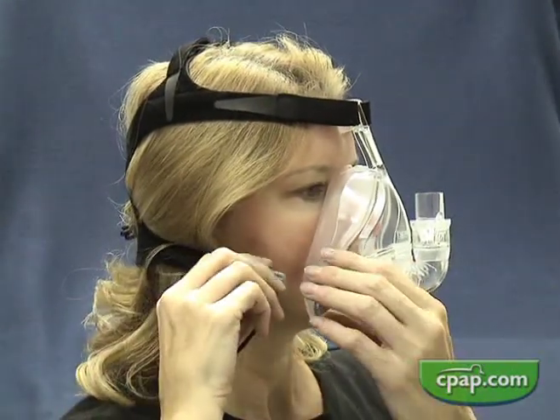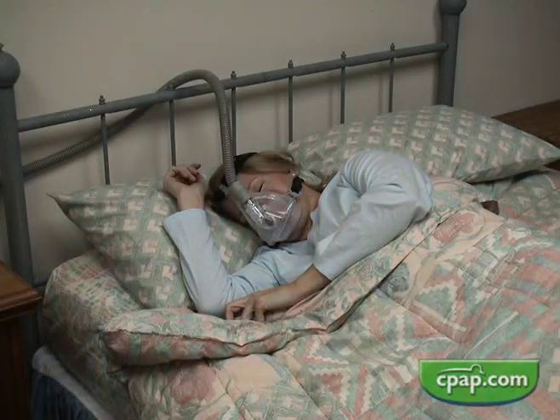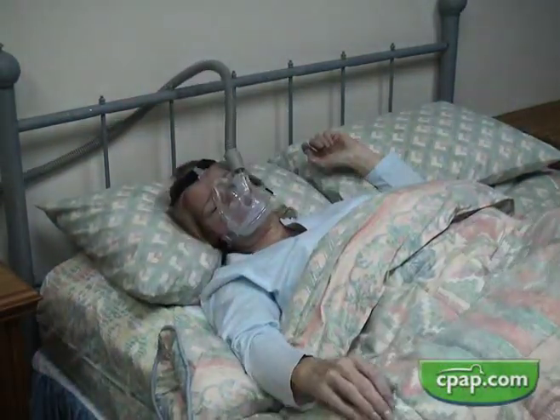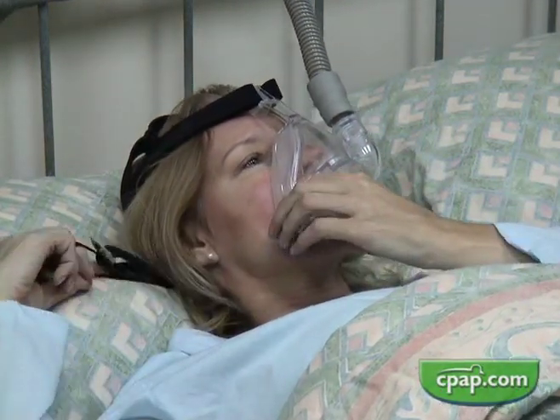No full face mask should ever be used by a patient that is vomiting or feeling nauseous. Pulling the easy release cord downward allows a rapid exit from the mask. Full face masks should never be used by anyone incapable of removing the mask unaided, in the case of vomiting and aspiration, without continuous supervision.